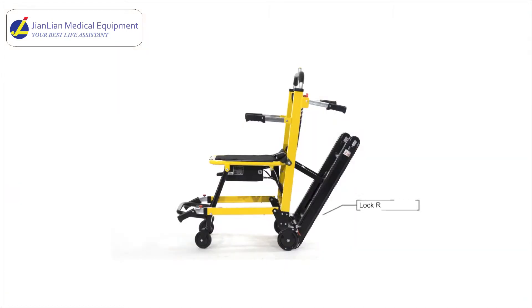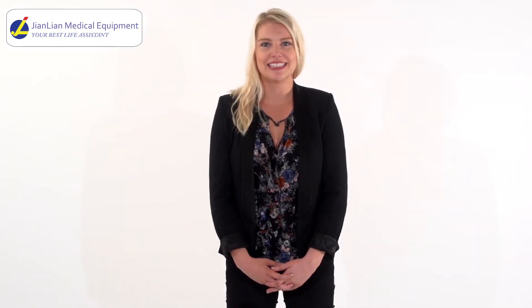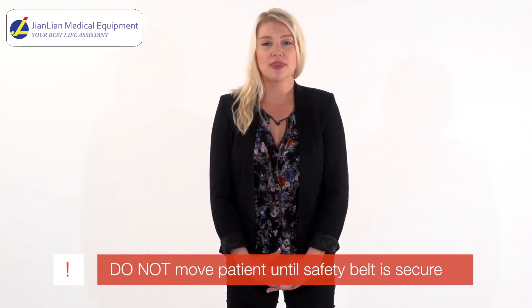Before transferring the patient into the chair, unfold the chair and ensure the rear wheels are locked. Sit the patient down and make sure that the patient's legs are on the footrest. Strap the patient into the chair using the safety belt. It is important that you do not move the patient until the safety belt is secure.